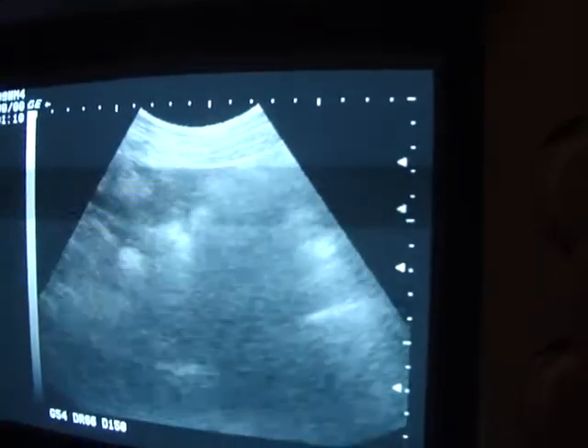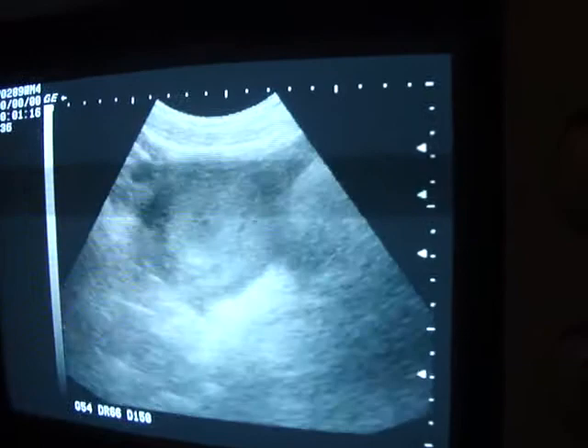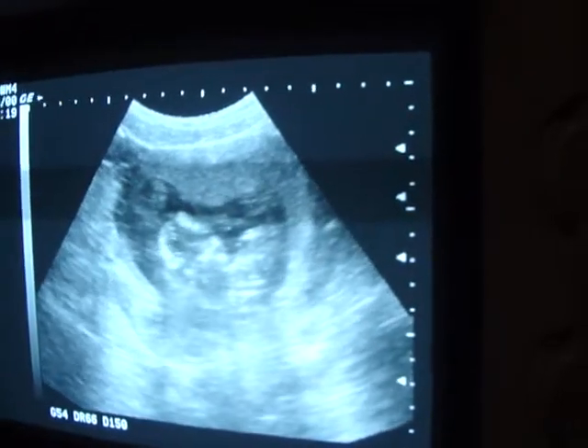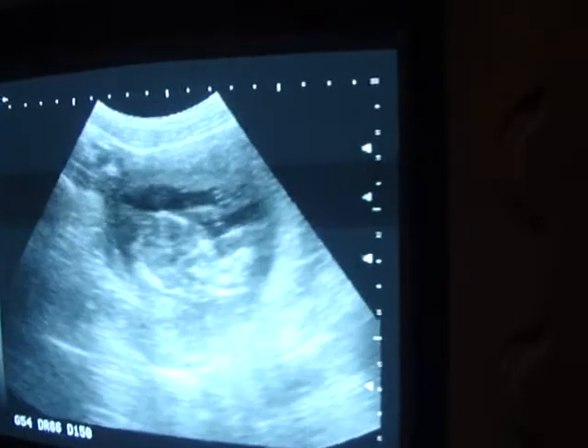I'm not going to get a face profile. That means you won't be able to see if it has a wee or not. Yeah, I'm not very good at that either. That's kind of one of those things. That's as close as I can get to a facial — I can see his ears and eyes.